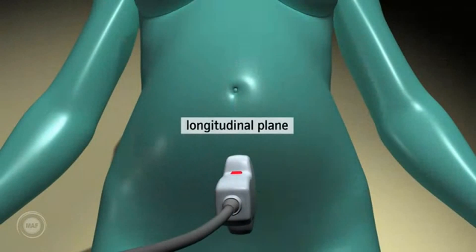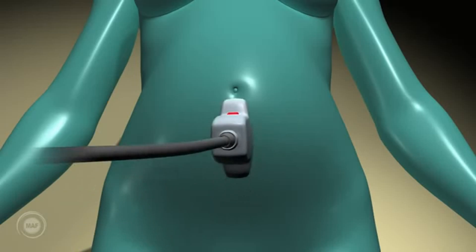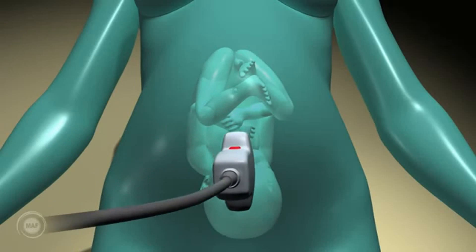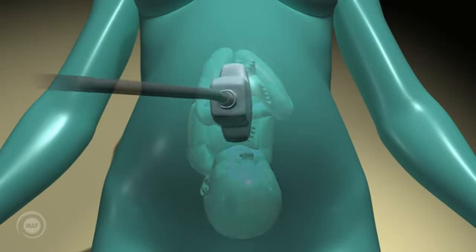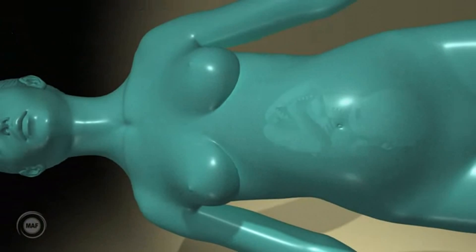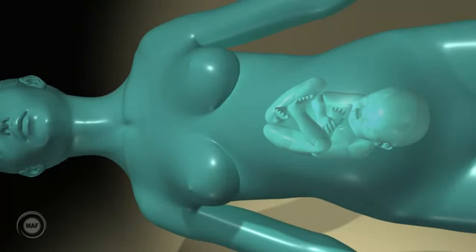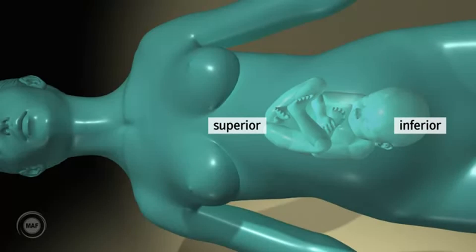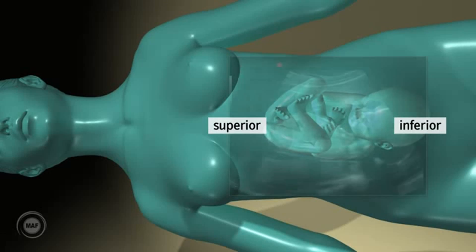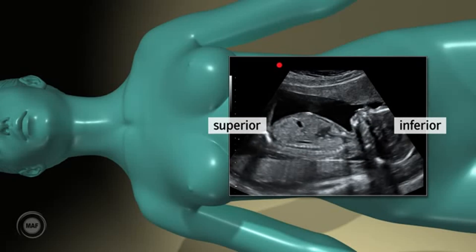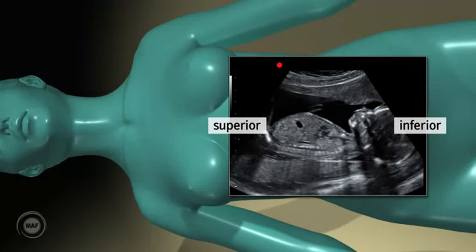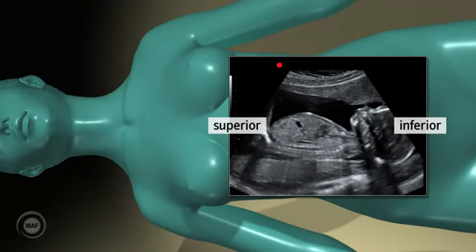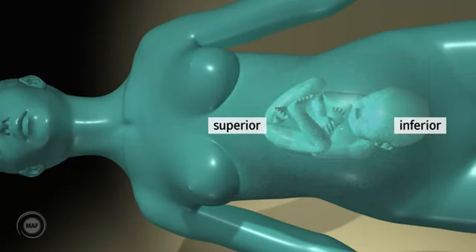If the probe is placed on the mother's pubic bone in the longitudinal plane, one must consider where the dot is on the probe and relate it to the dot on the screen in order to interpret the image. In the longitudinal plane, the left side of the screen represents the superior part of the mother and the right side represents the inferior part of the mother. So when scanning in the longitudinal plane, the mother's head is represented to the left of the screen and her feet to the right. The location of the dot on the screen should correspond.